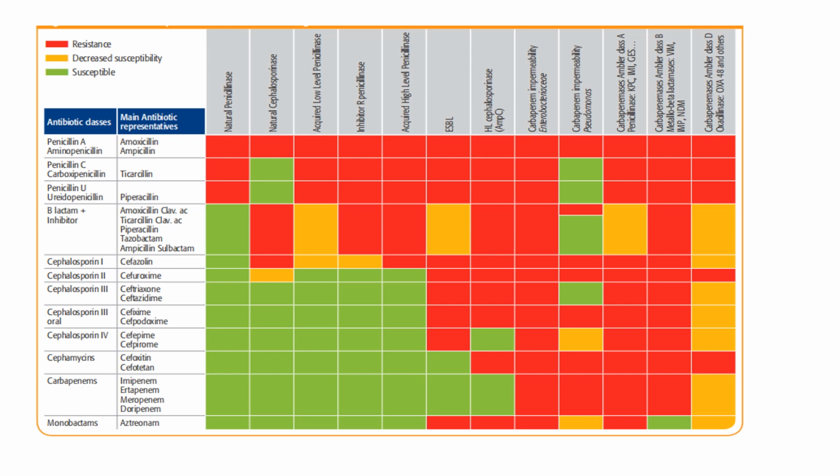Again, for ESBL, which antibiotic to select? The green ones are the susceptible, yellow ones are the intermediate, and red ones are the resistant. So we will select that antibiotic using this chart, which will be sensitive. Now the particular organism from this case study is an ESBL producer. So we will see the ESBL column, and here it says that cefamycins or carbapenems will be the drug of choice. If it had been an AmpC producer where cefoxitin would have been resistant, then the drug of choice would have been 4th generation cephalosporin or carbapenems.